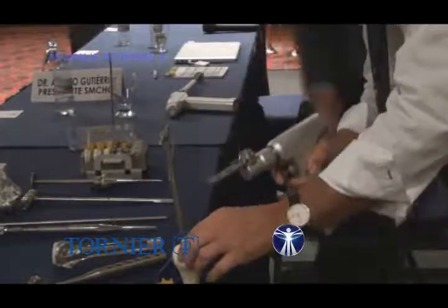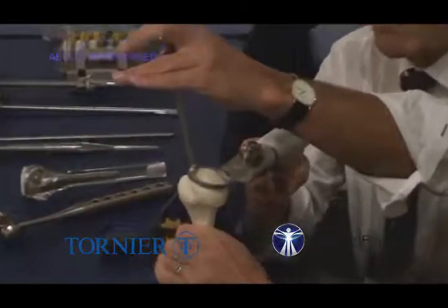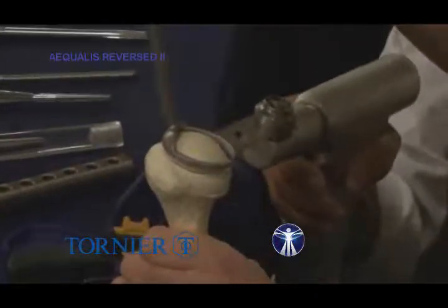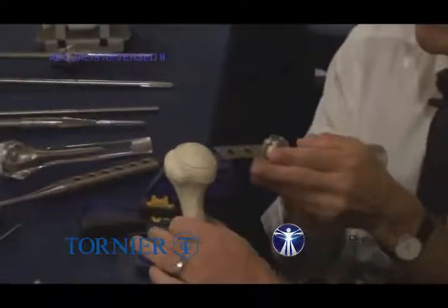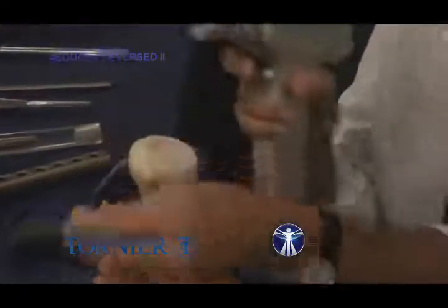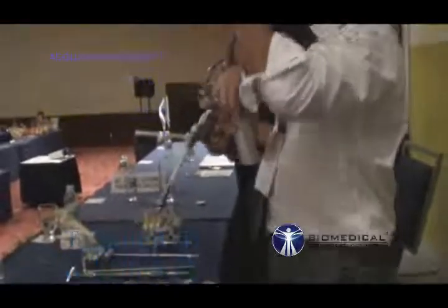So, what do we cut? We cut just at the top, in order to stay above the tuberosity, and I cut with this inclination. We start the cut, then we need to remove the nail. And you complete the cut. Now the cut is done — you have your retroversion, your inclination, and your height.